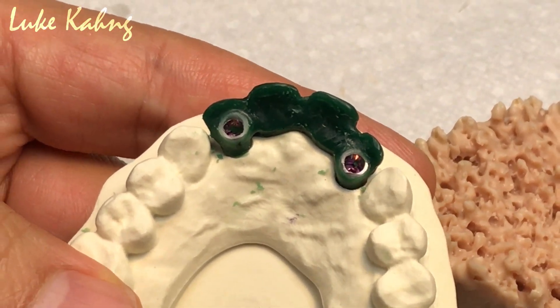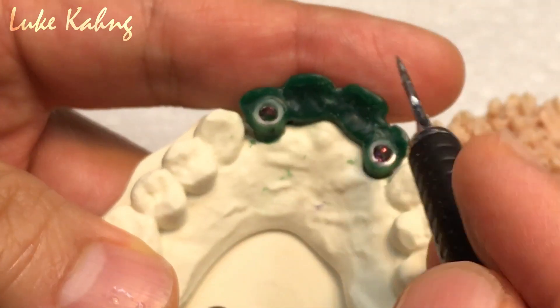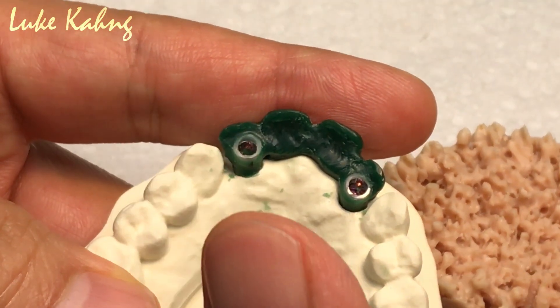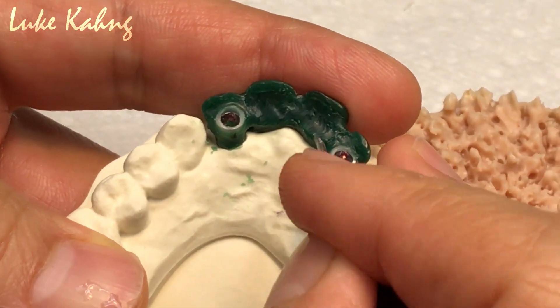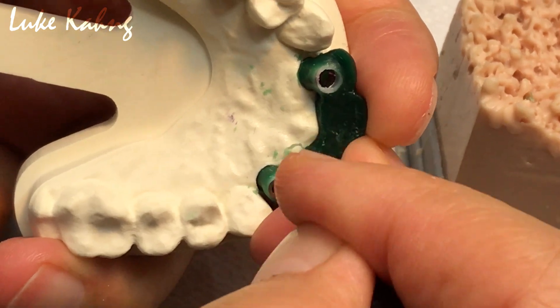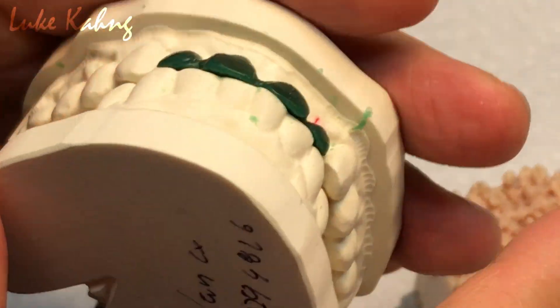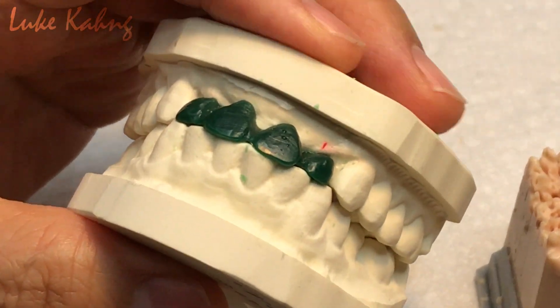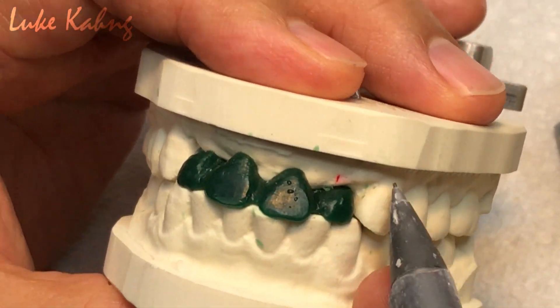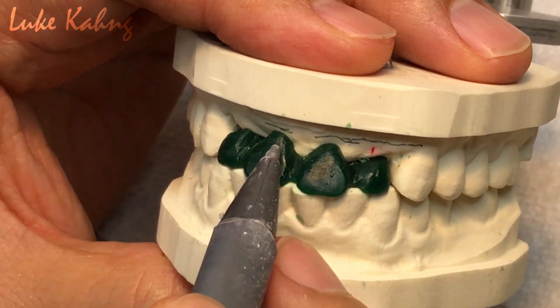So what I see, number one, I know we can cut it, we can shave down later. This one still we can bring in more modified, which is better. That area we can cut it. I like it a little smaller. There are more issues here. So like I said, this is K9. This is the finer. So now too long.